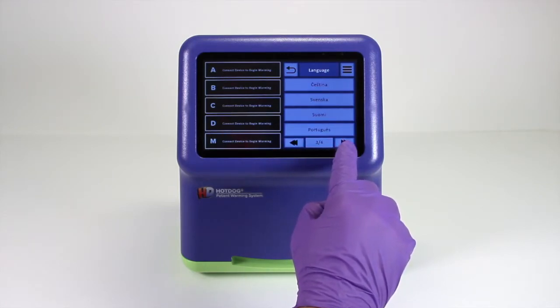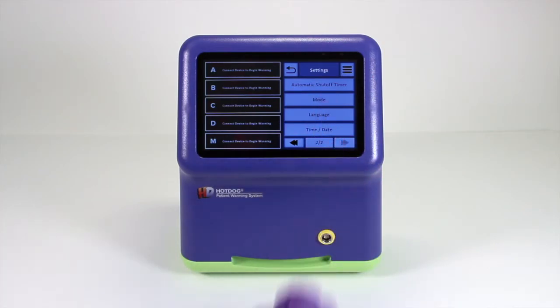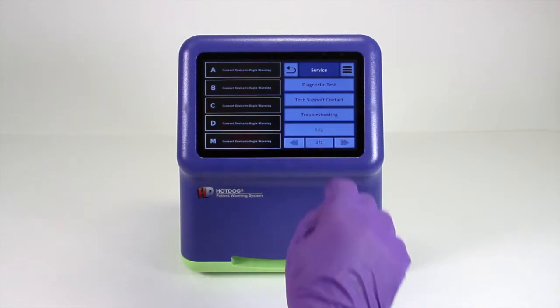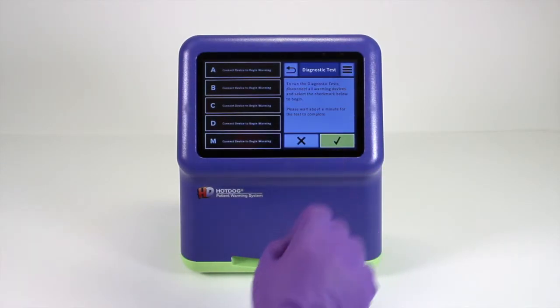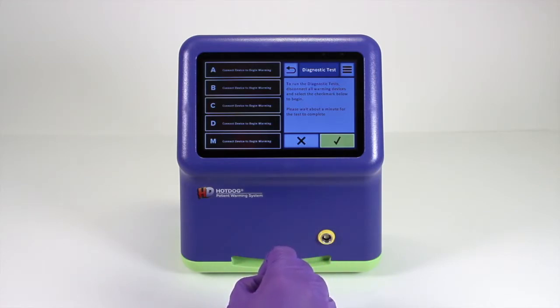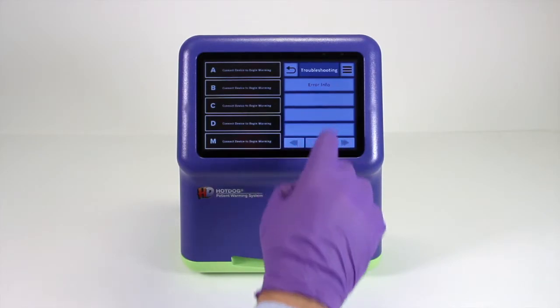There is also the option to display information on the screen in different languages — currently 15 different languages to choose from. The service section offers a built-in diagnostic test which eliminates the need for a separate test device to confirm proper function of the alarms. Troubleshooting information is also found in the service section.